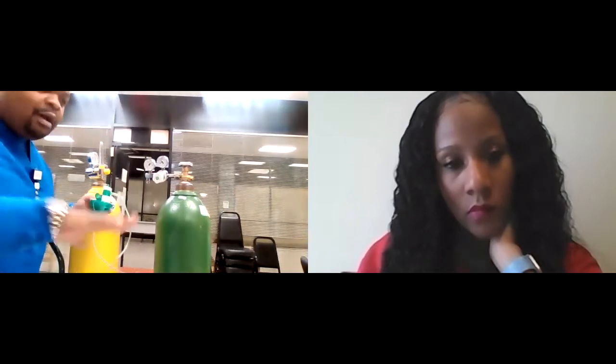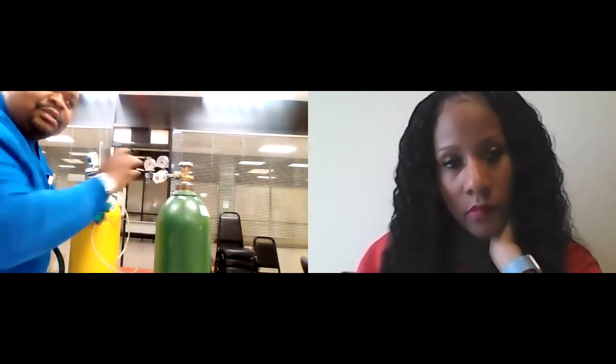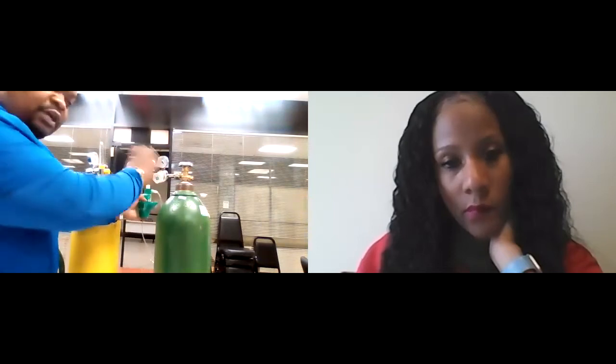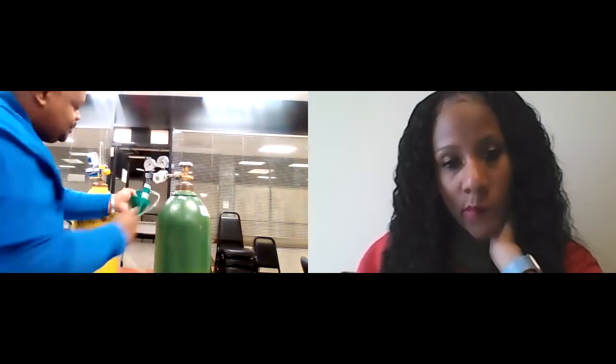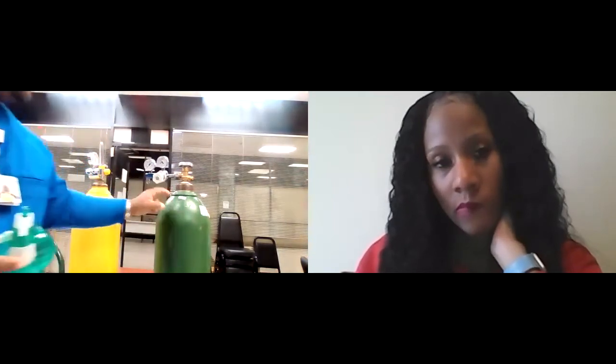I can hook it up, give them all that airflow, and just crank up the oxygen as needed to get them where they need to be, right? Or if they need a lot of oxygen, I can hook this up, flush the oxygen out, and then bleed in the air, right, down to what I want it to be. So like I said, you'll learn that a little later, but for us, we're gonna start on the oxygen. So let me get my water.